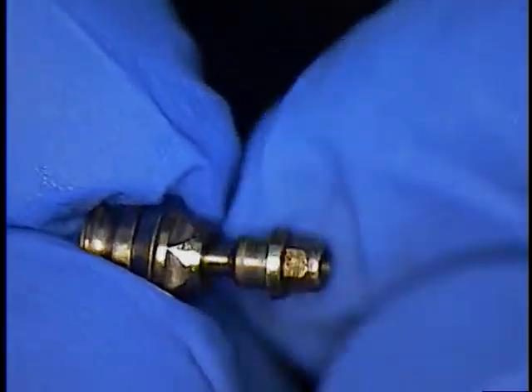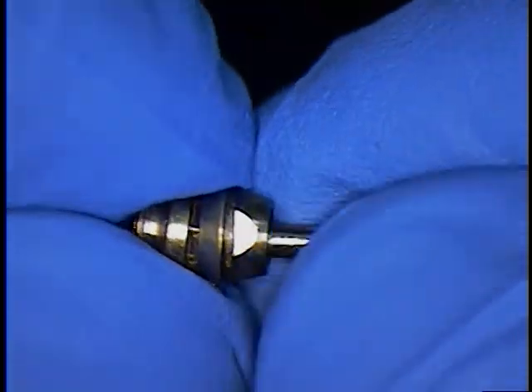It stayed, and it definitely did have a threaded component, but a lot of force was applied to that. It is an external hex Branemark implant. And this is the part that then goes to the top of that one. Let's hope that the other implant's okay. But it was evident once I looked at it. It's the top portion.